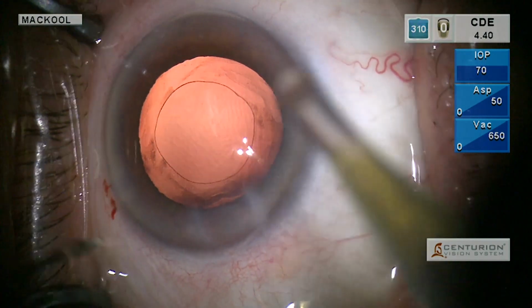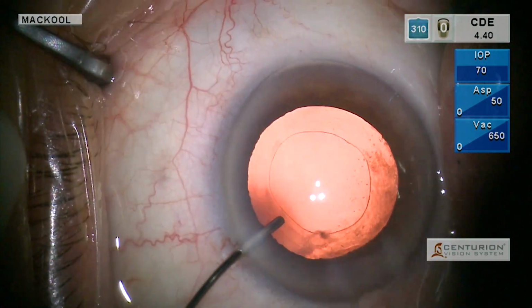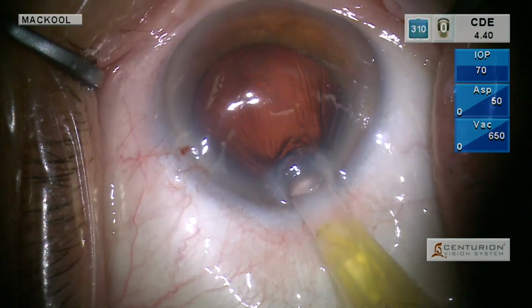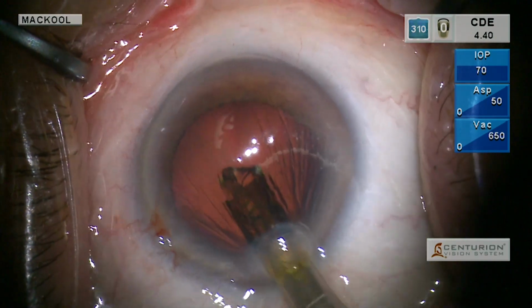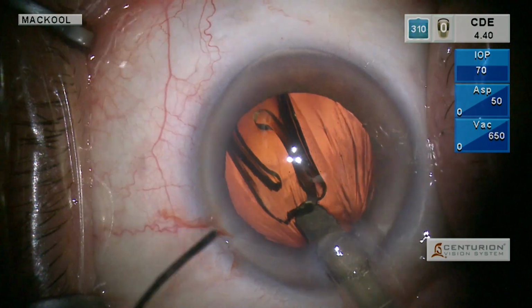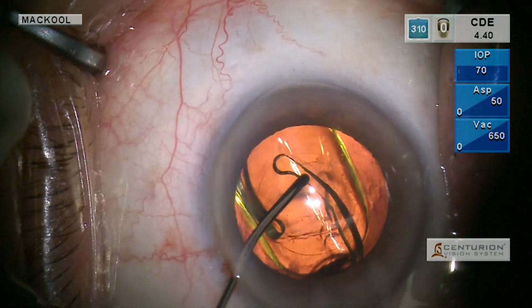So now I've got a nice clear posterior capsule, and we can just go ahead and inject the IOL. So if you're going to use topical, and even if you don't, sometimes with a block, the globe just isn't where you want it to be. So how are you going to get it there? It's your second hand, and you have to plan and practice how you're going to do that, because for sure you're going to have to do it sometimes.